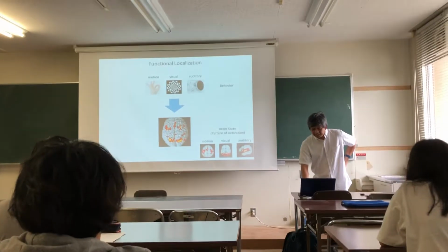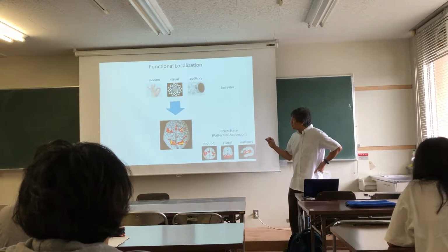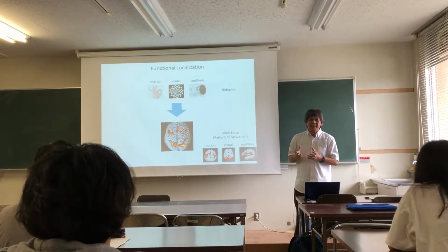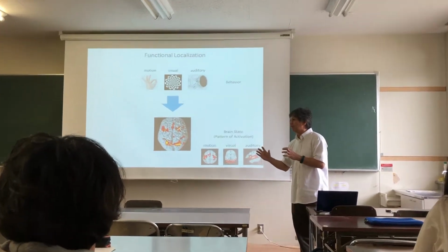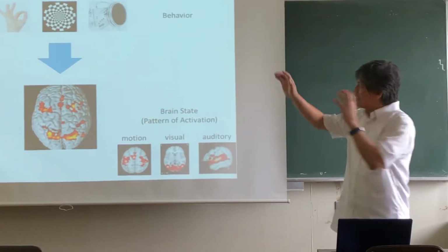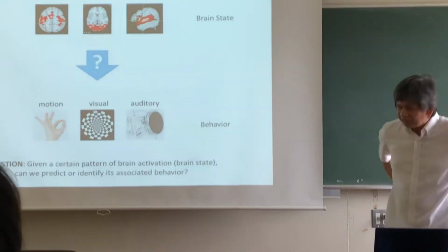Auditory task, you can see that the auditory cortex is activated. So this is just a simple task. You can create a more complicated task in order to identify the different areas that are involved for that particular task. Okay? But this is the standard approach of functional MRI.